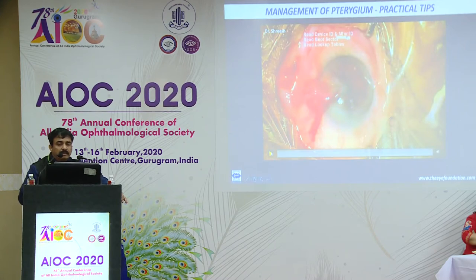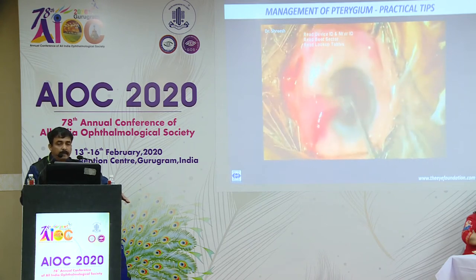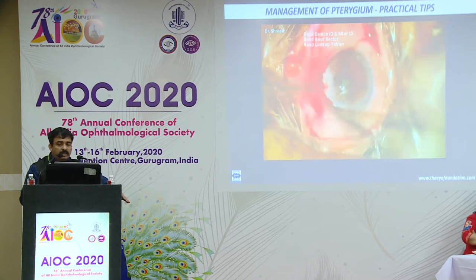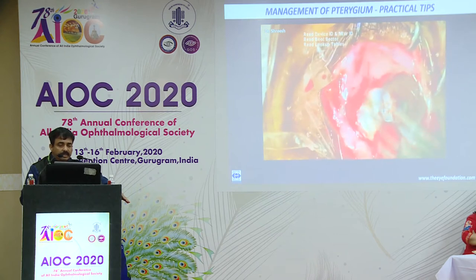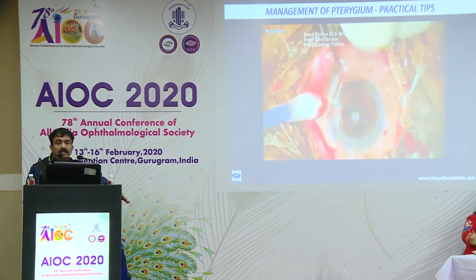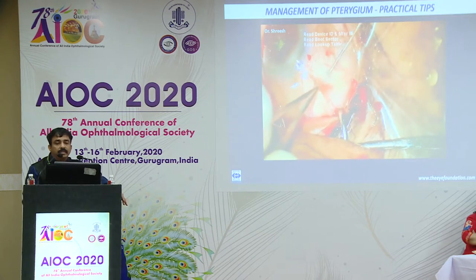Just a small video, I think most of us are following the same technique. I usually inject lignocaine subconjunctivally, so the patient can cooperate for the surgery. The pterygium head is averted, and the fibrovascular pterygium tissue is excised. Usually aim for 3 millimeters clearance from the limbal margin. That will create almost 5 millimeters of bare sclera, roughly, because of the elastic recoiling of the conjunctiva.